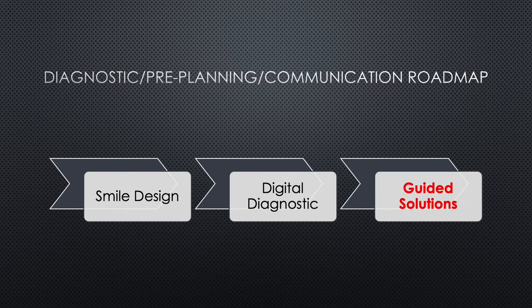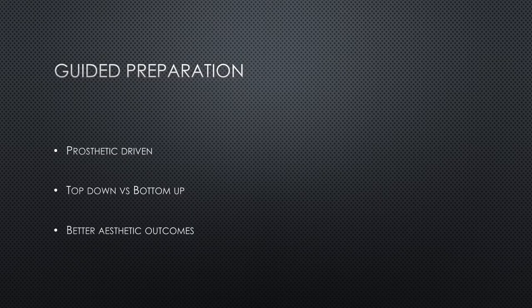But really, when you get them to sign off, like I said, you can really help them out a lot by doing these guided solutions, right? And something as simple as making a silicone matrix for them to use in a mock-up, that's a guided solution. So the reason is because it's prosthetic driven, it's facially driven, it's from the top down rather than the bottom up, right? You're not trying to make these things match the margin that may be staggered, and it gives you better aesthetic outcomes, it gives you more predictable outcomes.